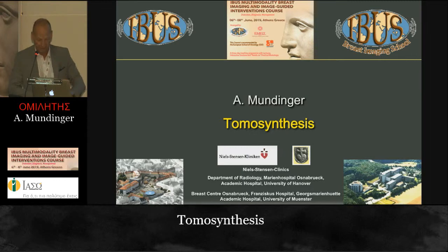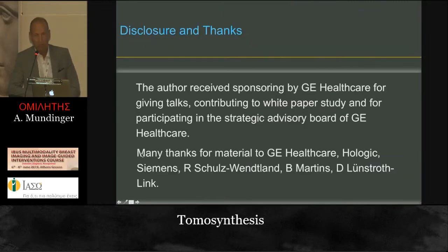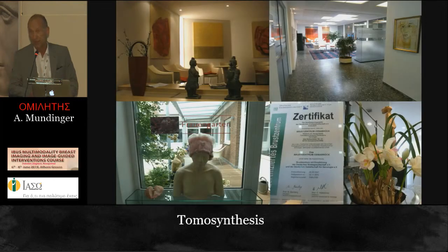And our topic is tomosynthesis. And tomosynthesis is something that is particularly interesting for radiologists. So maybe you can give me a short overview. Who is a radiologist? Okay, thank you. The second question, who has a tomosynthesis at home? Okay, so the majority will probably not be too much interested in details, but nevertheless I included it.